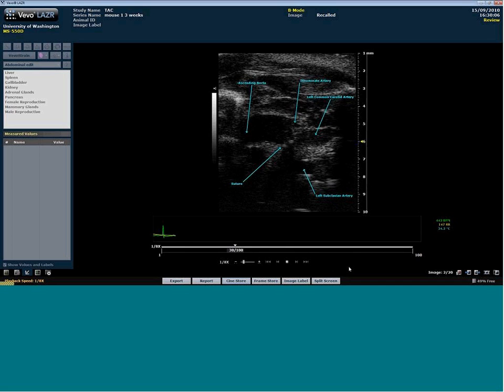Considering how that would perform on the 2100, if you can, because they don't have the 2100, so they're interested to know how we would deal with that issue on the 2100. If you could just speak a bit about the relationship between center frequency and maximum velocity.